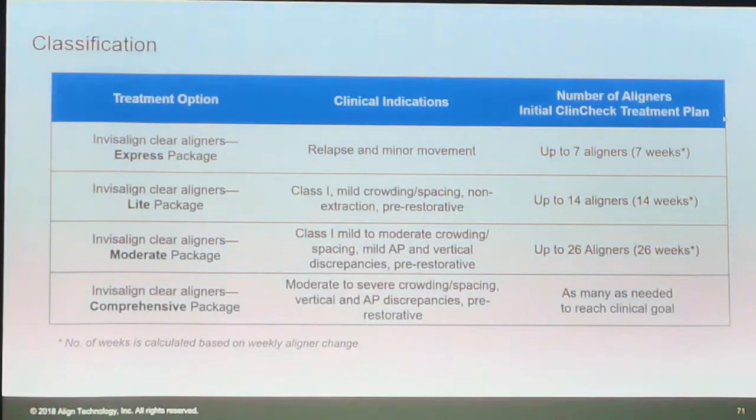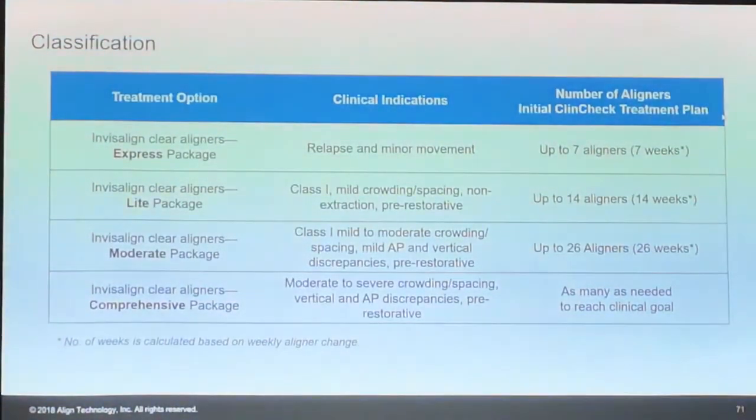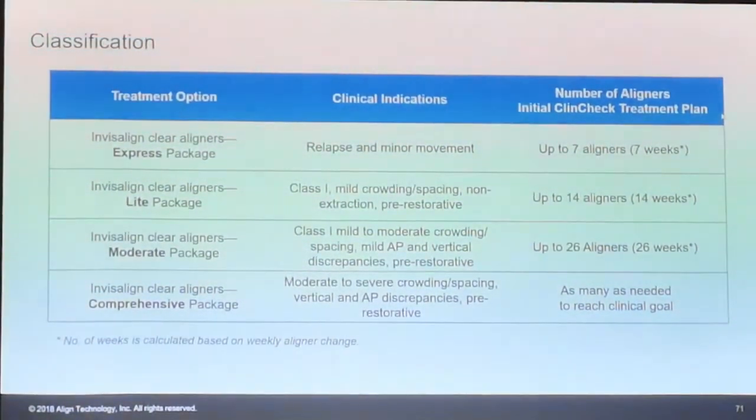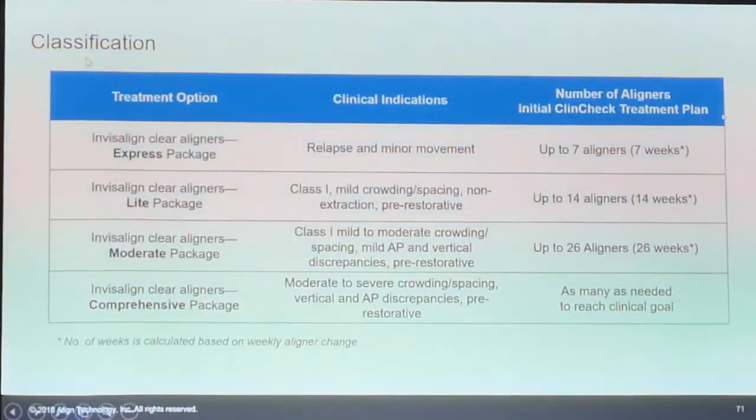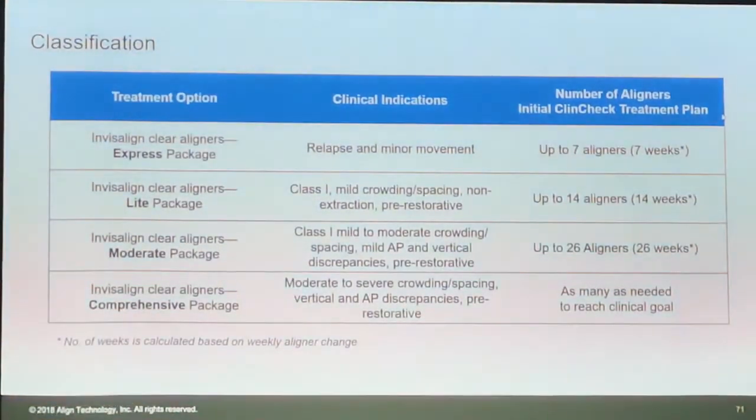So far, if you have any questions, you can tell Kun Chu or Pom Pam, and later on, when we finish all the sessions, I will answer all the questions. So the next part I would like to introduce to you is the Invisalign package, because today, once you submit, you have to choose which type of package you would like to submit the case with.